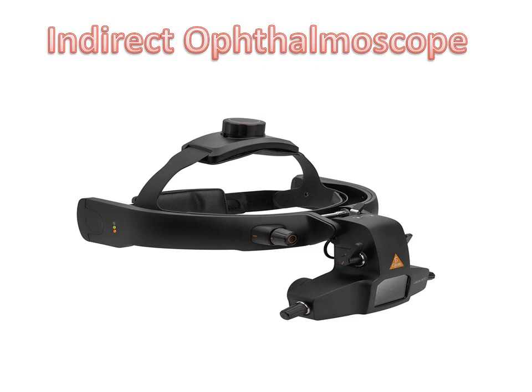The mechanical part is this headband. The illumination part is the light that is present inside the indirect ophthalmoscope. And the optical part, you will have one eyepiece for the right eye and one eyepiece for the left eye, which have to be adjusted according to your interpupillary distance. So as I told you earlier, just like any other ophthalmic equipments, it has got three parts: an optical part, an illumination part, and a mechanical part.